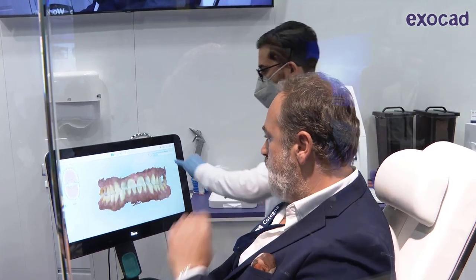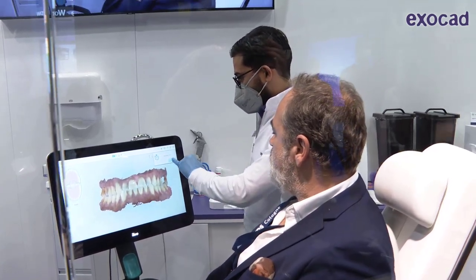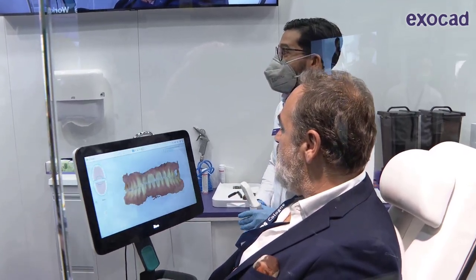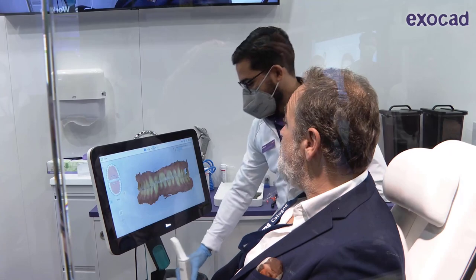This scan will now be calculated and sent to the cloud, where it will be seamlessly integrated into ExitCAD with all patient details.